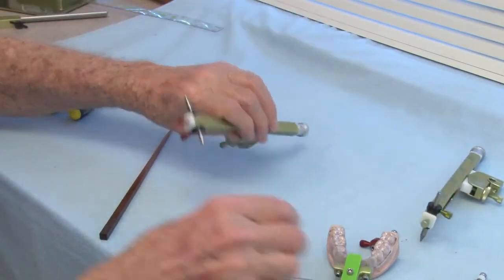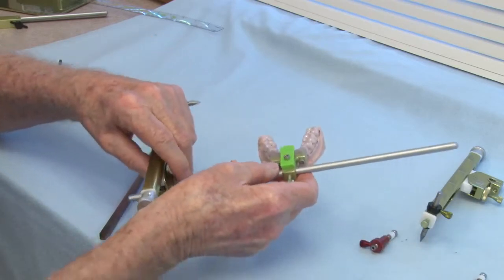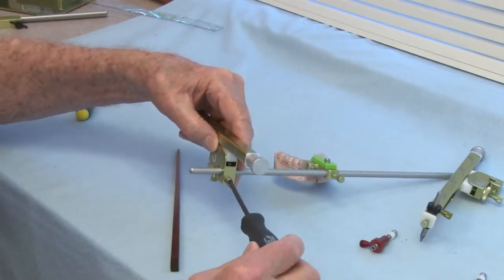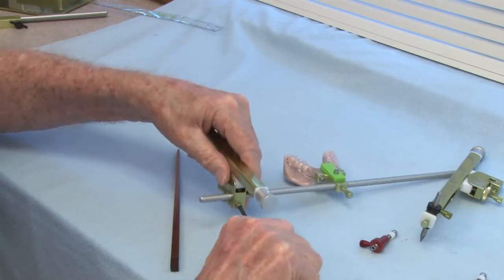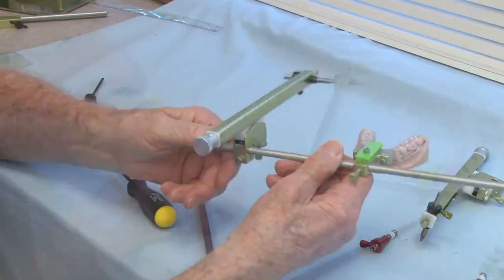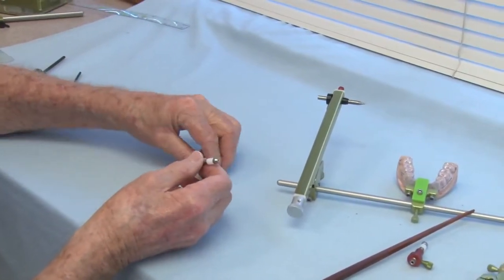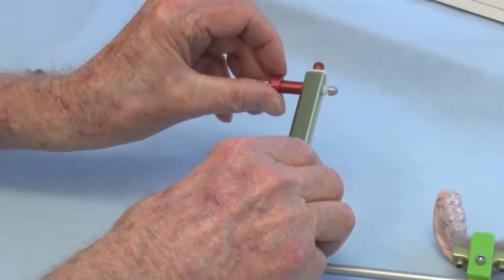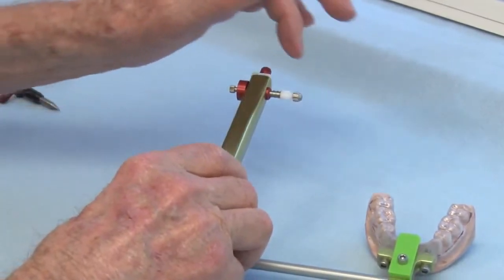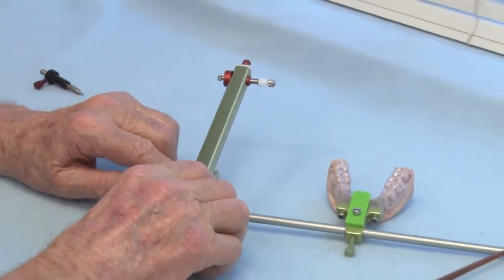Now, the side arms would actually fit on the crossbar on the patient's lower jaw, like so. And you use the Allen head hex wrench and tighten the side arm in a fixed position. The writing pencil, you take lead and put into the writing pencil, and the writing pencil then would fit on the side arm like so. And when the patient moves, the lead would actually draw the actual movement pattern of the patient on our flag assembly that I showed you earlier.